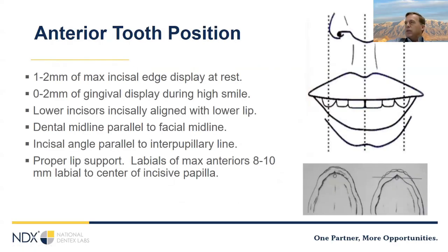Again, most of the time your laboratory will be setting your teeth, but one of the things to keep in mind when you're working with dentures is that most of the things that affect a denture we can't see in the laboratory. We can't see the lips, we don't see the cheeks, we don't see the tongue. And so many times we're needing a proxy from you to show what those things are, and it's the bite block.